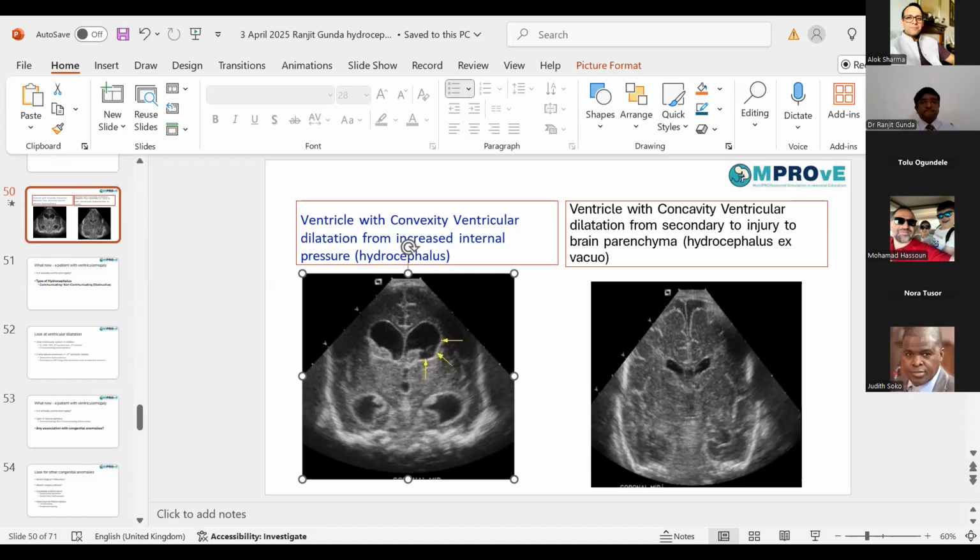So you must always clinically correlate, because it is also well known, and I will show you a case on Sunday where you can have hydrocephalus with quite significant ventriculomegaly with raised intracranial pressure, which becomes arrested because you're able to basically have flow through the ventricular system established. And that, from our perspective, helps and causes the hydrocephalus to start settling down. But at the same time, ischemic injury to the brain has happened. And because of this ischemic injury to the brain, what happens is you start developing cerebral atrophy. So you can have a combination of both.